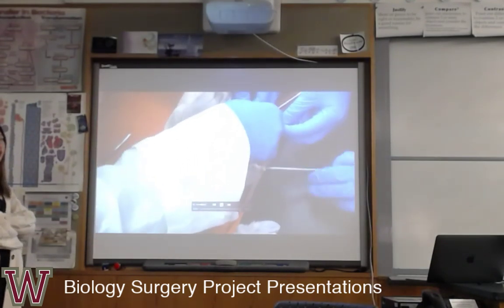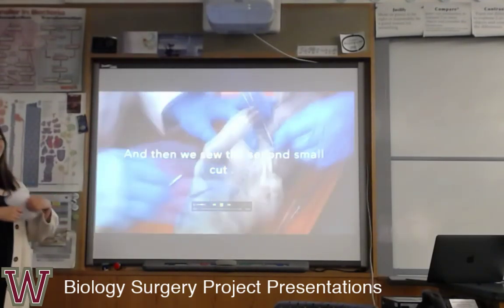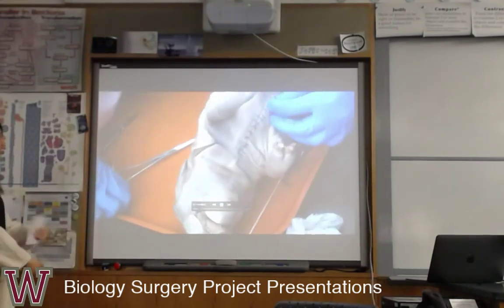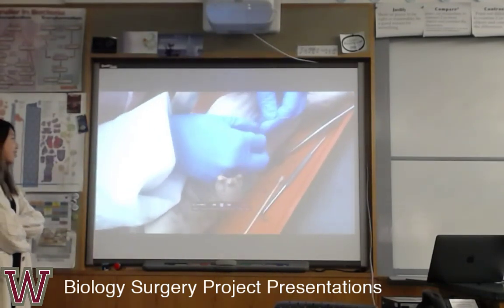It's hard to make a knot like the surgeon tying on the scissors, and I don't know how they could do that. So this is the second cut we're going to sew.